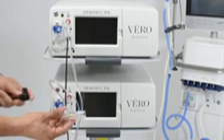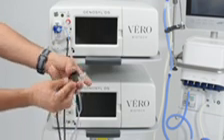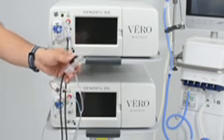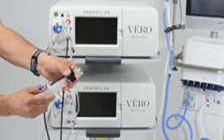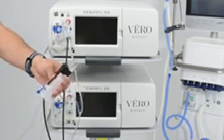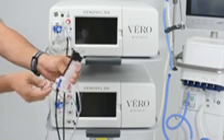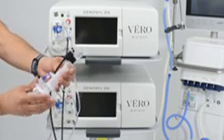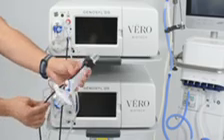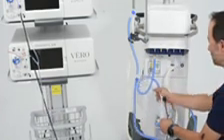Connect the adaptive sensor to the adaptive sensor cable by aligning the gold tabs and snapping the connector in place. Connect the adaptive sensor to the injection adapter. Connect the red NO injection line to the injection adapter. Connect the inline breathing circuit filter to the distal end of the injection adapter. Place the injection assembly on the dry side of the circuit prior to the heater humidifier.